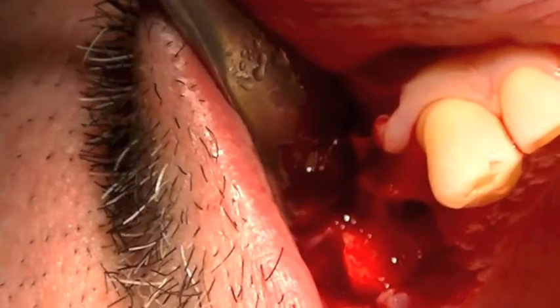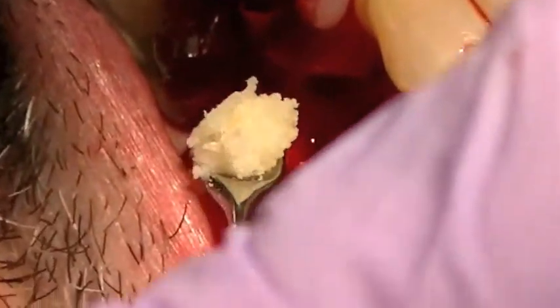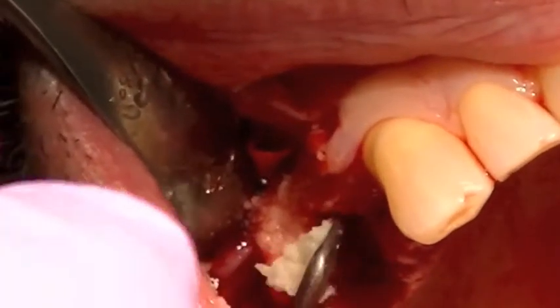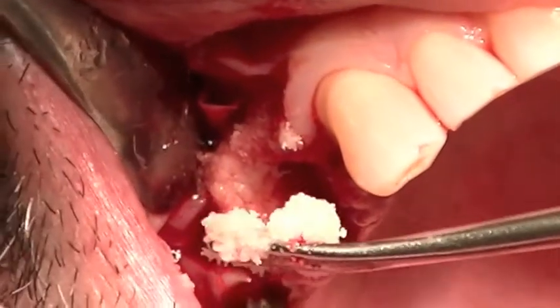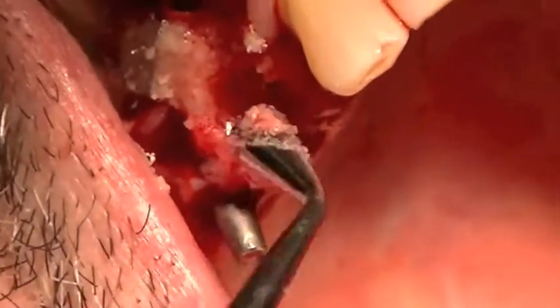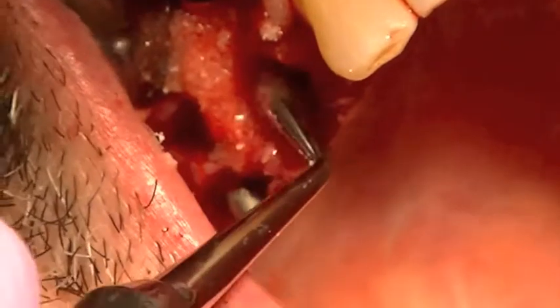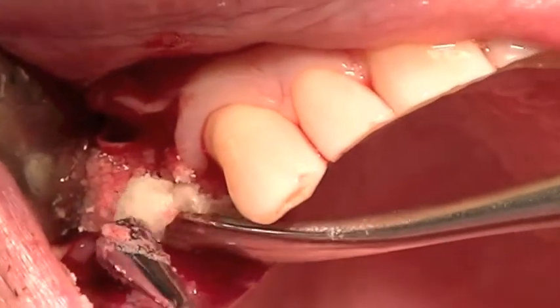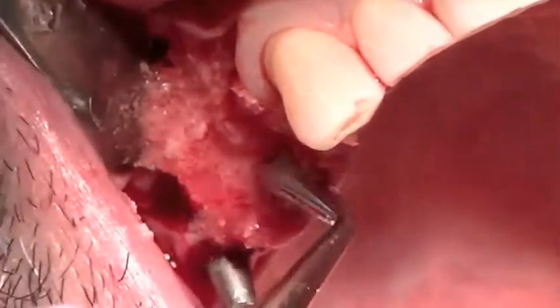It will be very easy for me to take this material to the site and simply pack my allograft material into the facial defect initially, but then into the remaining socket site. We're trying to prevent further bone shrinkage and prepare a site for a future implant after proper healing. I'm not packing firmly — rather I'm lightly packing the material, trying not to break down the crystal, so that we're doing it in a proper dimension.